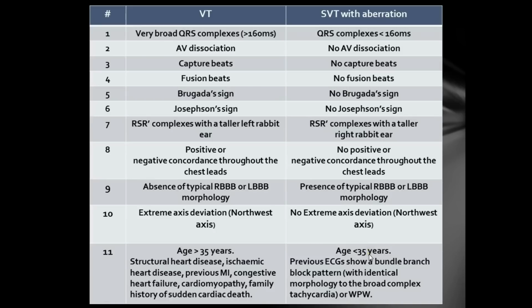And in conclusion, I'd like to say that these are not all the criteria, but there are also a few other criteria mentioned in some algorithms, such as the Vereckei algorithm and the Brugada algorithm.